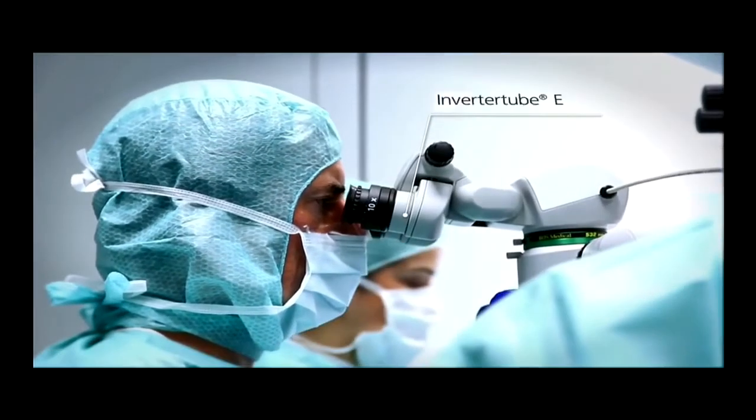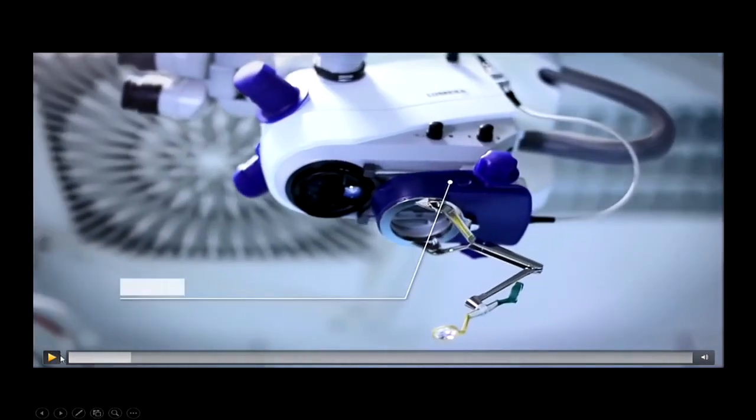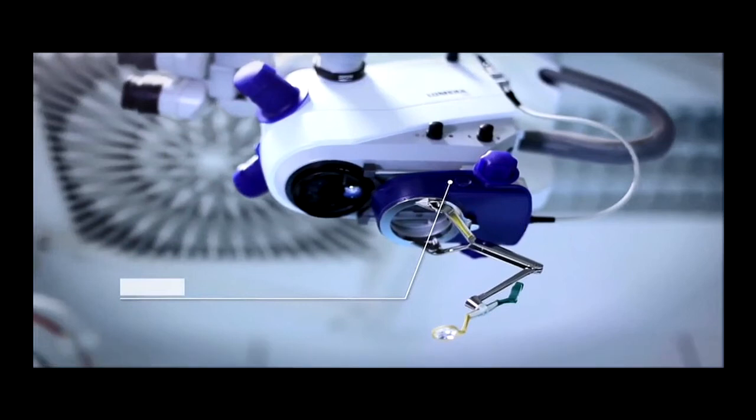So you have the inverted tube. What you can see here is the ReSight system, and the focusing lenses are within the system. Here you can see the wire here, which is motorized. Now what they have done in ReSight 700 is, they have combined the microscope foot switch and the motor of this one. So as soon as you pull the lens into the system, the inverter gets activated in the ReSight.